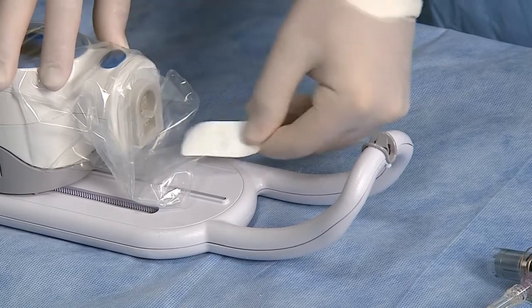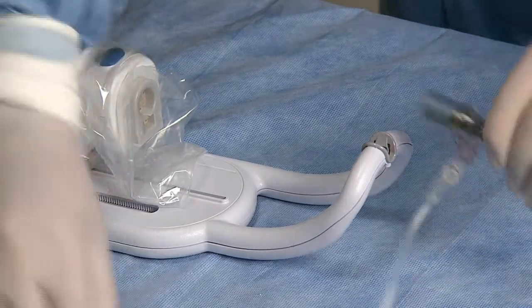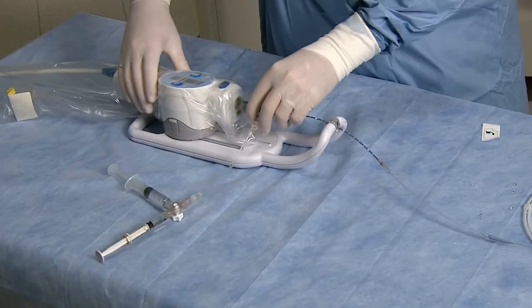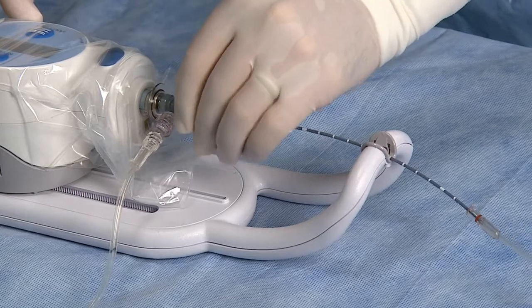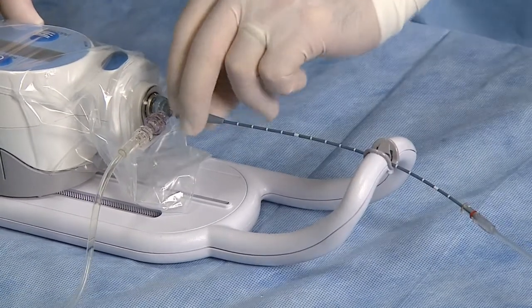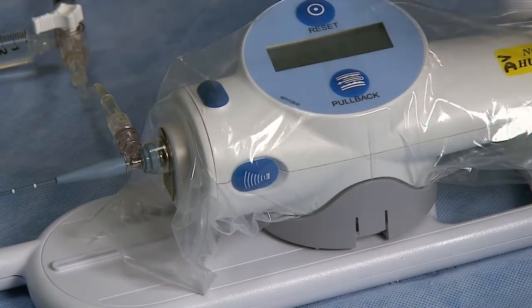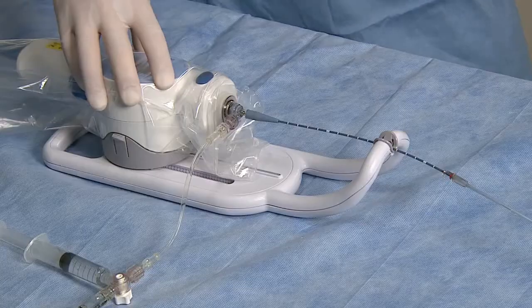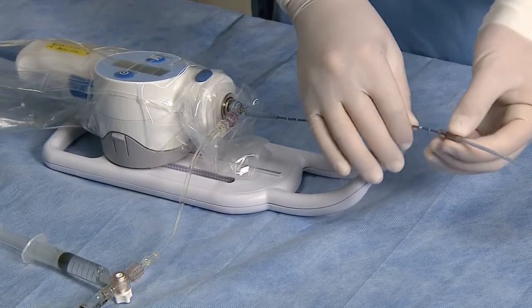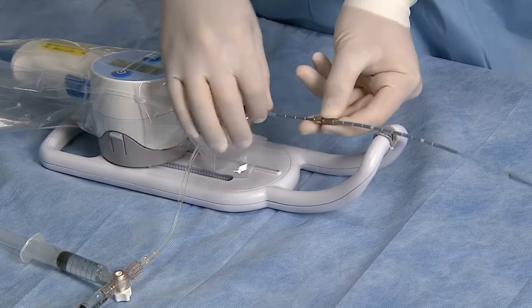Connect the catheter to the motor drive and press the imaging button to ensure it is functioning properly. With the motor drive activated, close the telescope by moving the transducer to the fully distal position.